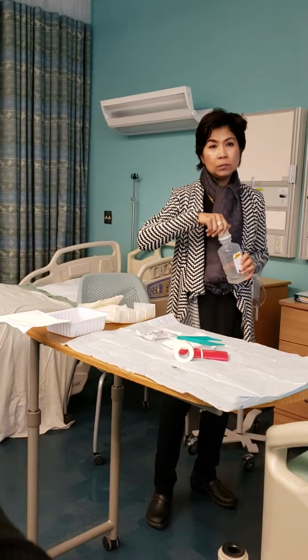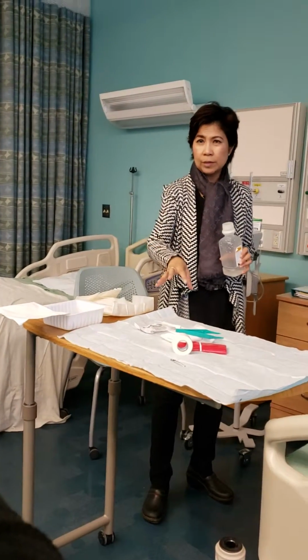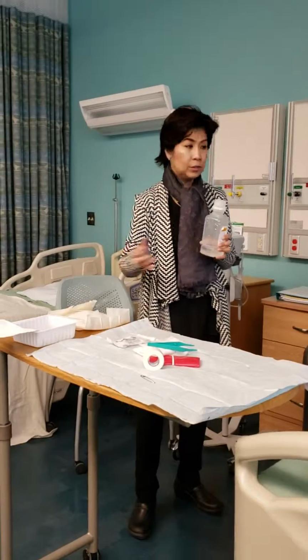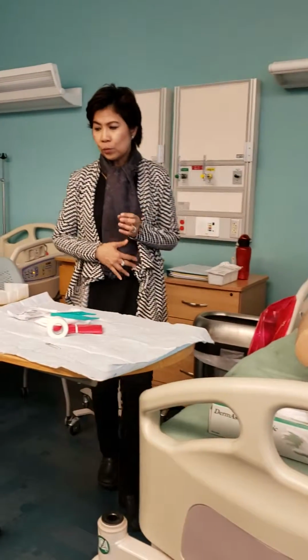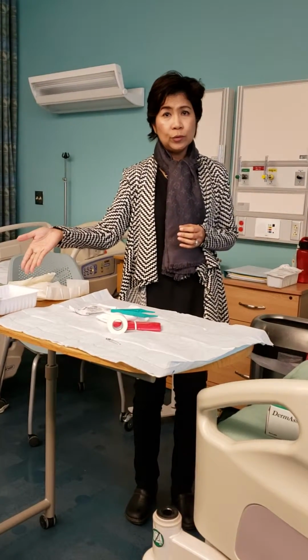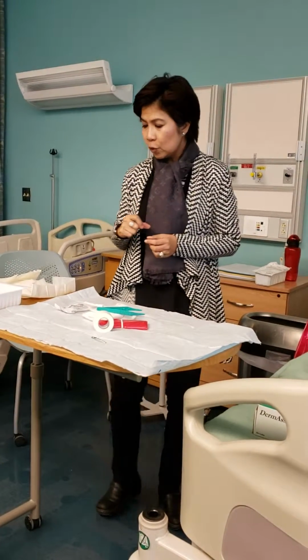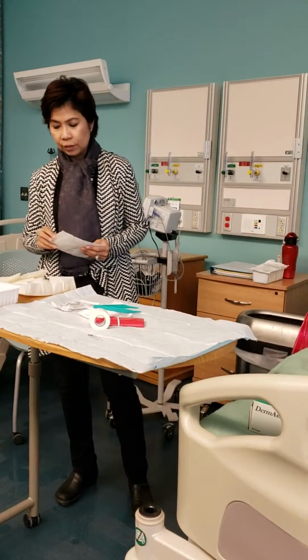And don't make any splatters, because the splatter might contaminate your work area. So make sure you are containing the normal saline within the tray. And this one you don't need anymore. You can put as much as you like here when you're doing this in a clinical setting. It depends on how much gauze you need. For example, I need more gauze because there's not a lot of gauze here.